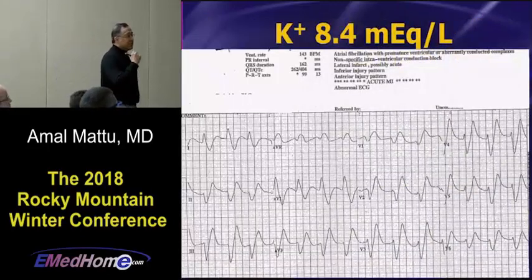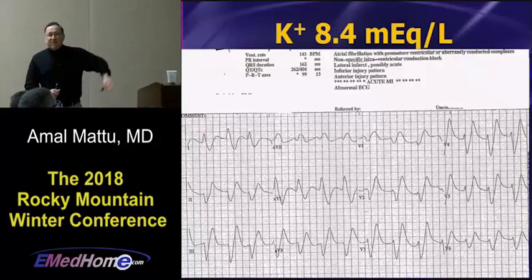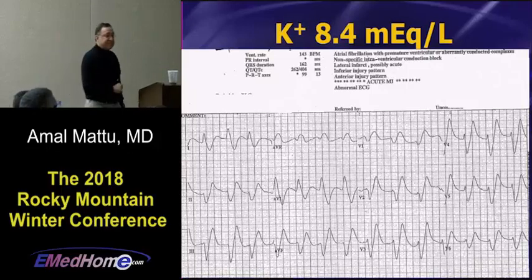All right, let me show you just a handful of more cases of hyperkalemia, just to really hammer this home. Some of these are going to jump out at you and be really, really obvious. By the way, take a look at the computer interpretation at the top. It's calling this a STEMI.